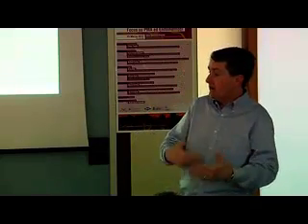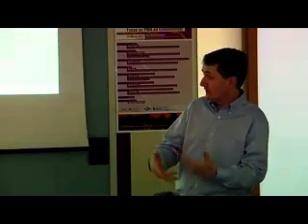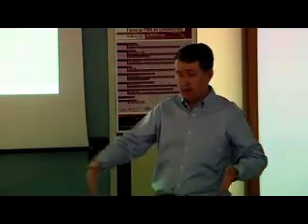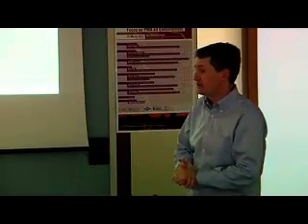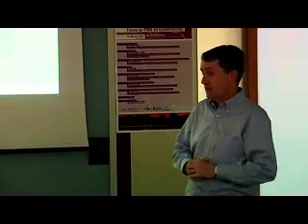I think there are many promising technologies in the pipeline that will allow us to identify which embryos are healthy or which embryos are most viable without having to keep them in culture for very long periods of time. And Michael talked about one of them, the Unisense machine, where you look at the cell division profiles of the embryos and you get a handle on whether the embryo is healthy or not very early in the process.